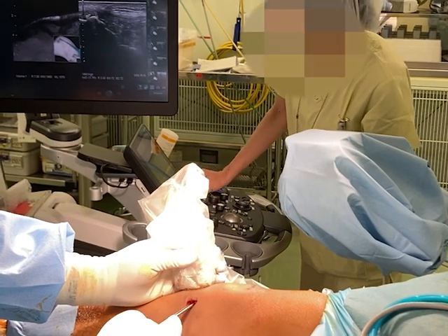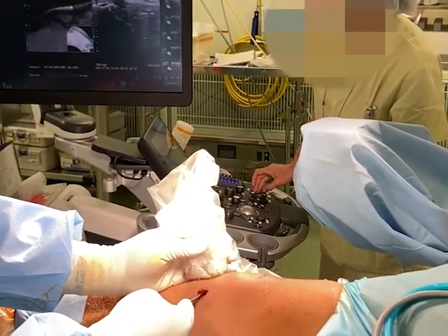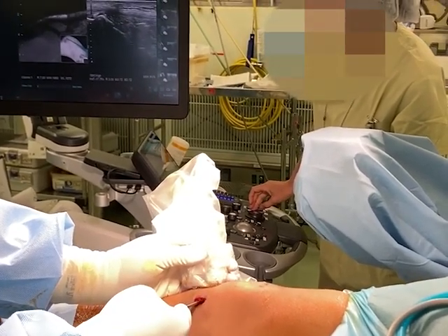The patient is positioned supine on a standard operating table. The knee joint angle is set at 20 degrees, the same as during MRI scanning.